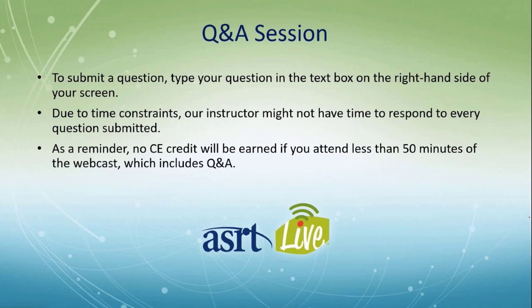Yes. Okay. The first question is, doesn't changing kVp affect the shape of the histogram, though it may not affect contrast due to the LUT? And again, I tried to clarify that shape. I'm not saying that the shape isn't changed at all. I'm just saying that the change in the shape is not a narrowing due to increased contrast. That's a false concept. I'm not suggesting that the shape doesn't change at all.